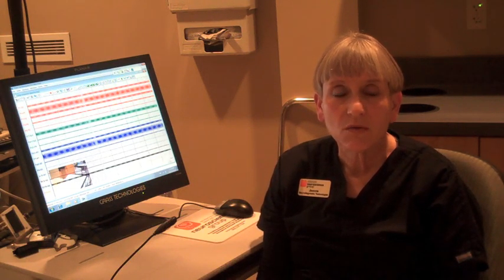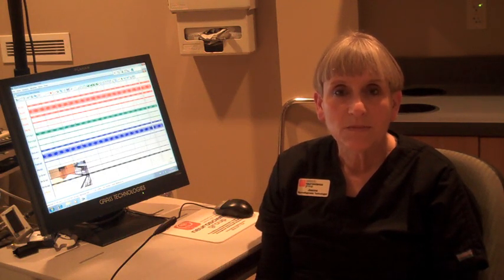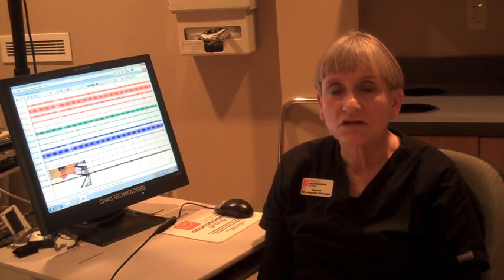An EEG is one of the very simple tests, easy to do and hopefully very relaxing for the patients. We have the patients just lie down on a cart, and I will be measuring their head and placing the metal discs on their head in designated areas. These are surface electrodes — there is no pain involved. We use a Q-tip with a cleaning solution, rubbing on the small area of the scalp where the wire or electrode will go, and then we put on a little paste or cream and place the electrode in it.